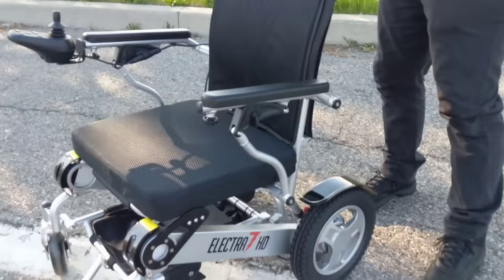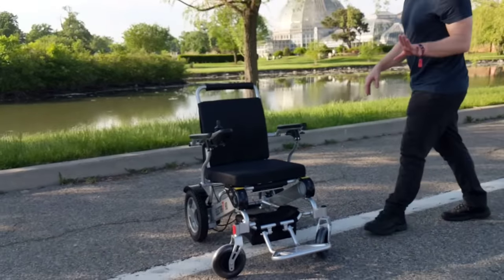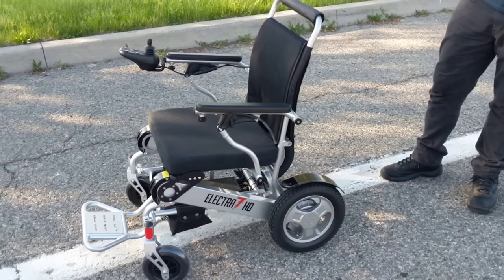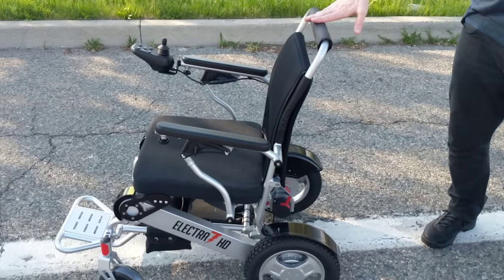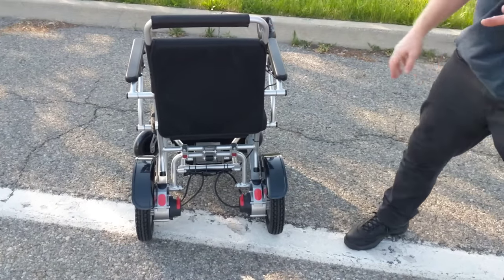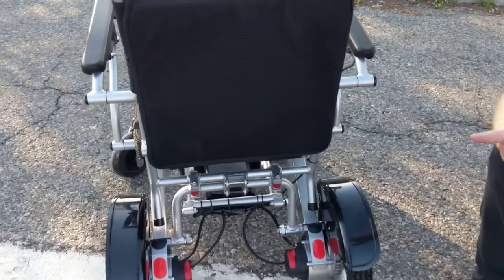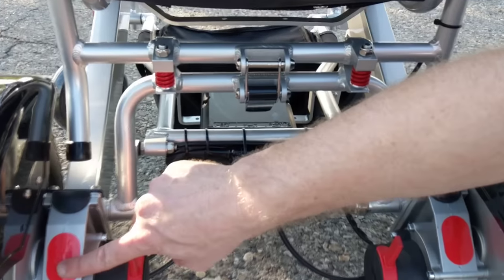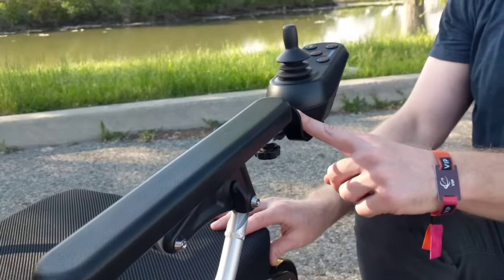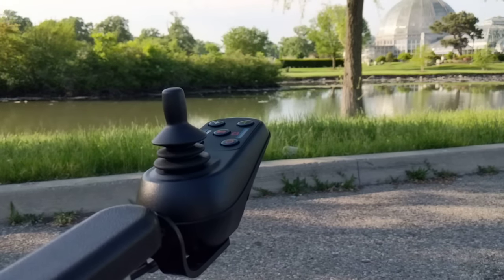The next couple of things I'm going to speak about are probably extremely important, because one of the common questions we get — especially from people that used to own the heavy duty power chairs, the big heavy things that you need a hydraulic lift to move — is what happens if there's an issue, what happens if the chair breaks down? We do offer a two-year warranty: first year is parts and service, second year is parts only. But what could actually break with this chair? We have the two 250-watt motors, the brain of the chair, and the joystick. There's not a lot of things that can break, and we stock all of the parts in our United States warehouse.